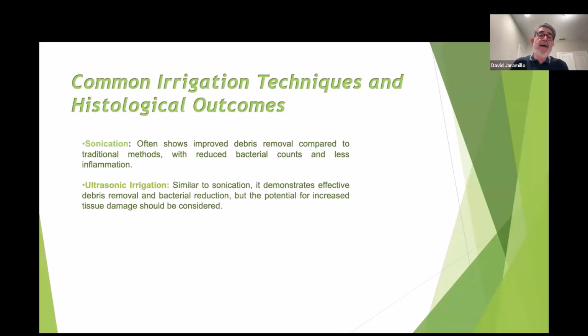But what they found was a lot of root canal transportation and a lot of pulp tissue remnants inside the root canal after the instrumentation. So basically, these techniques didn't survive the 80s. I have never seen anybody else doing sonication or ultrasonication instrumentation of the root canal. Those papers are found in the Journal of Endodontics back in 85, 88, 89.